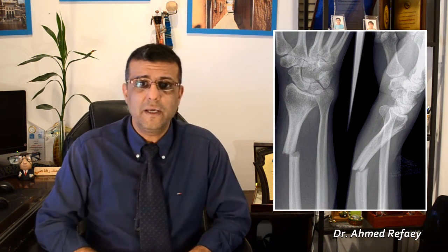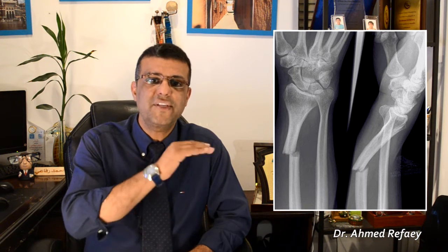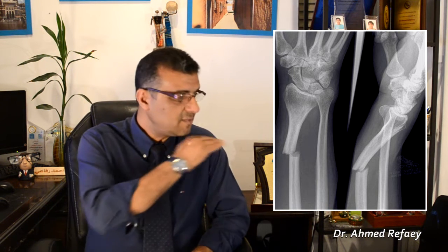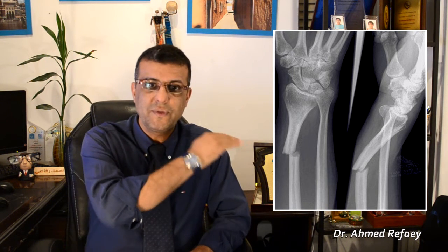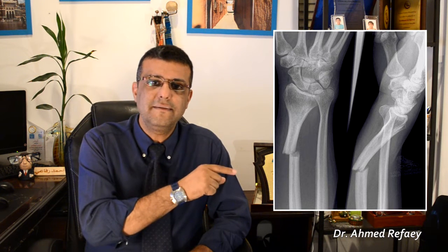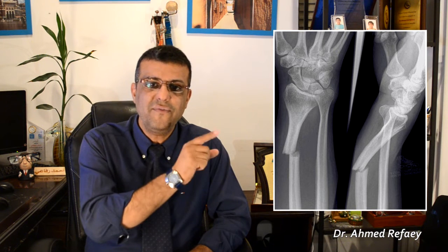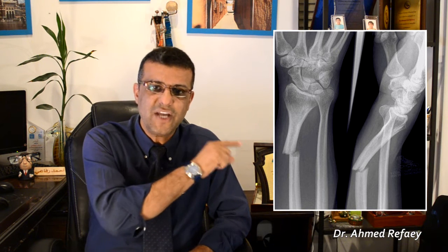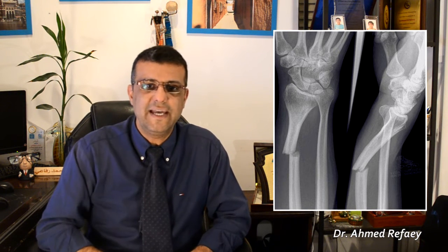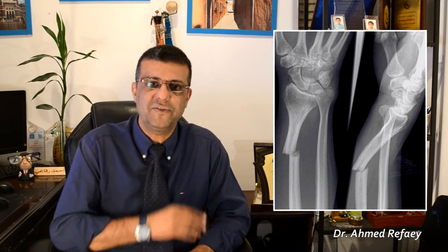Starting with case number one. This is a complete fracture, meaning it involves both sides of the cortex. It is transverse and simple, meaning only two bone fragments. This is a complete, transverse, simple fracture involving the shaft of the left radius — extraarticular because it is away from the joint.